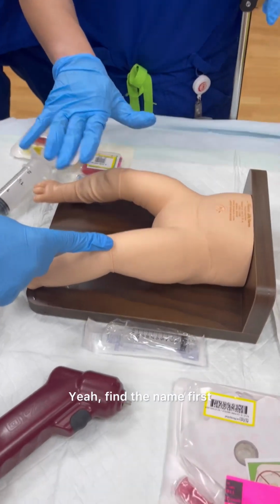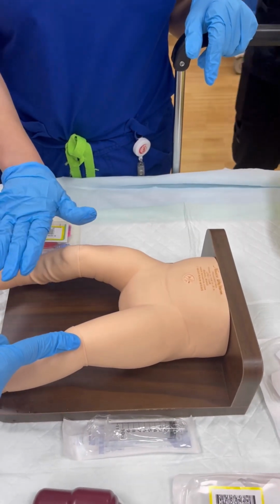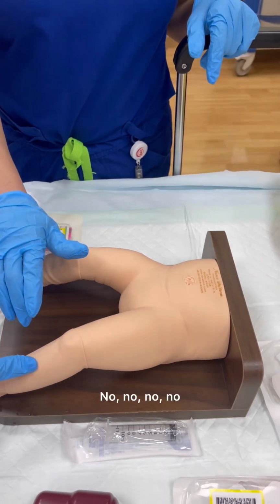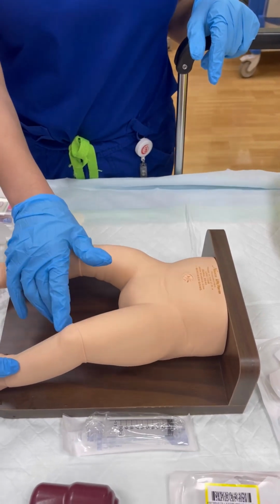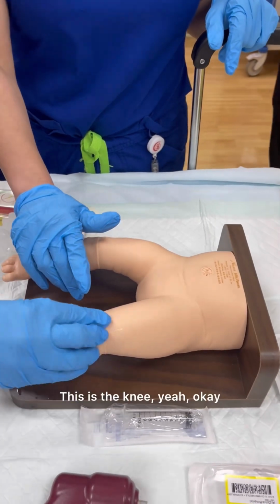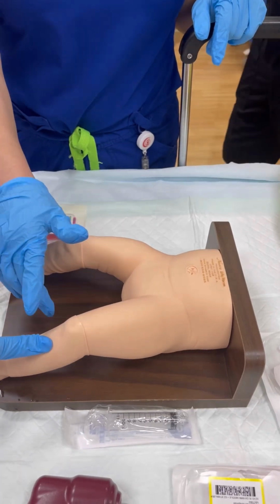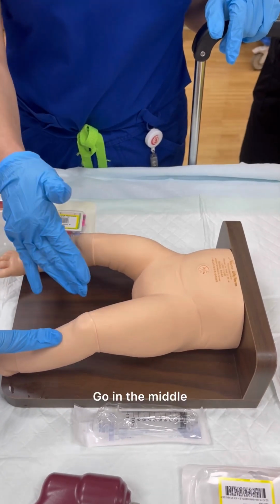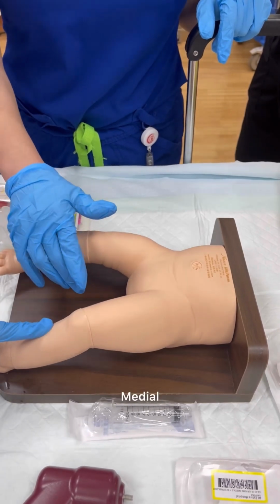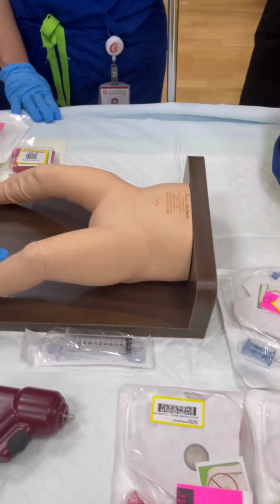Next landmark. Direct me. Find the knee first. Now go down and find the tibia. The tibial tuberosity. So I go back to the knee. This is the knee. Now the tibial tuberosity. Good, it's here. Go in the middle. One centimeter medial, not in the middle. Medial, yes. There's the region. You see?